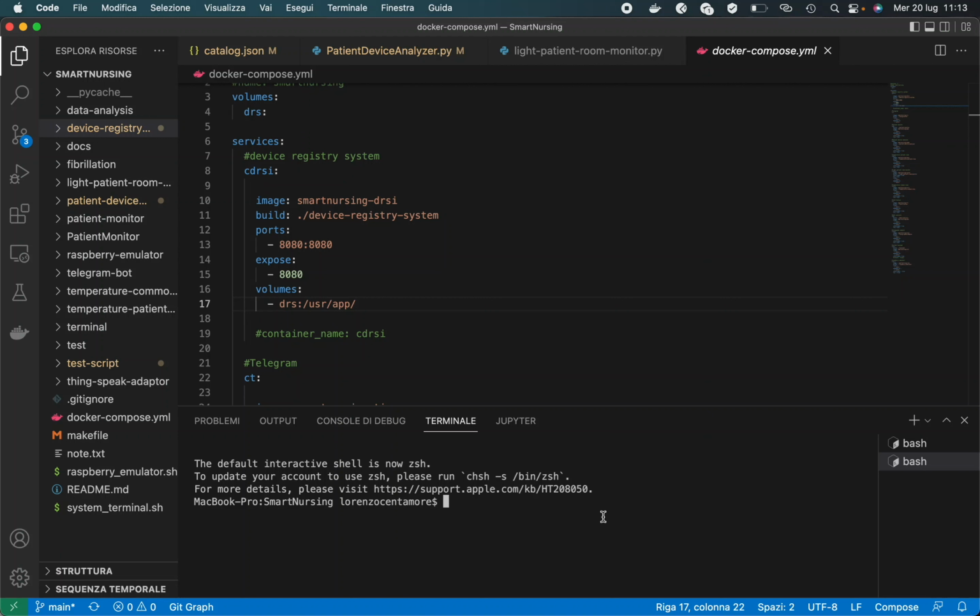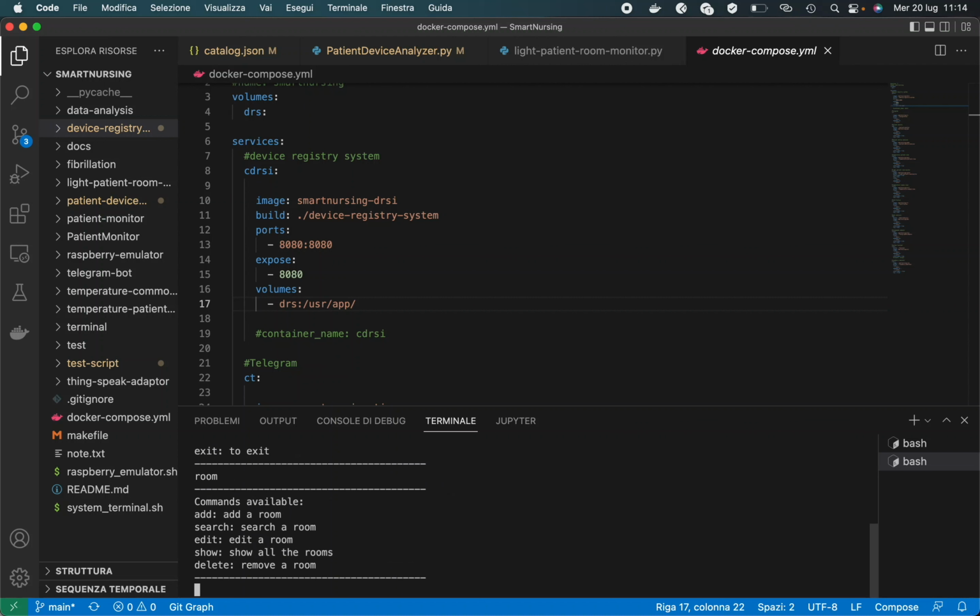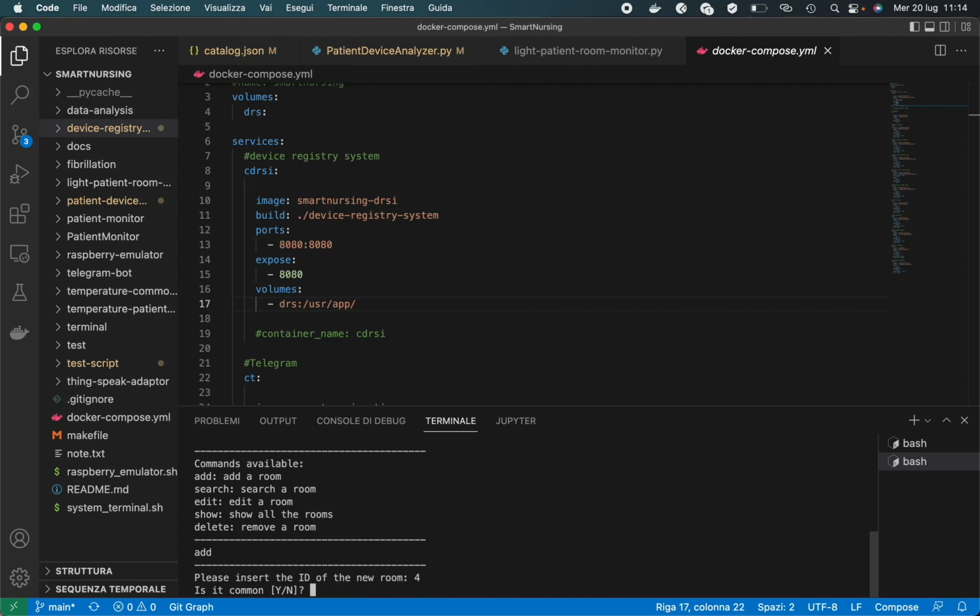I can remove a patient, which means unplugging the sensor, and if it happens accidentally, the patient device analyzer will detect the patients that are without a sensor attached, sending a notification to Telegram. Since this check happens periodically and not instantaneously, in the meanwhile I will open the command line of the terminal microservices. This allows adding, removing or editing users or rooms in the catalog at runtime. The persistence of the data is guaranteed thanks to the Docker volume that is defined in the Docker compose.